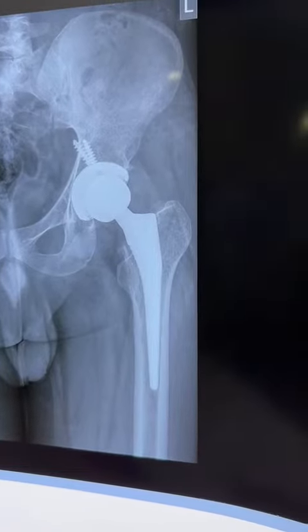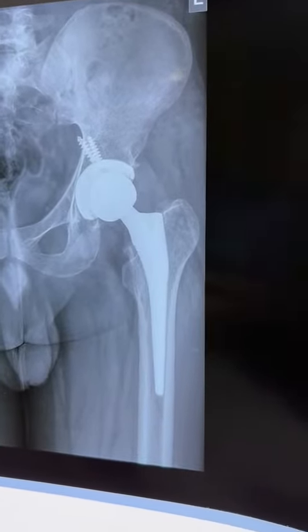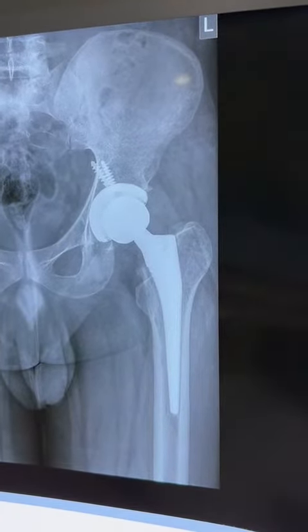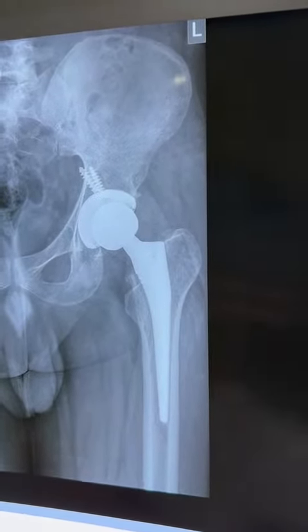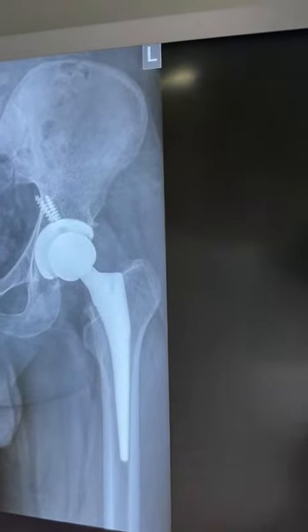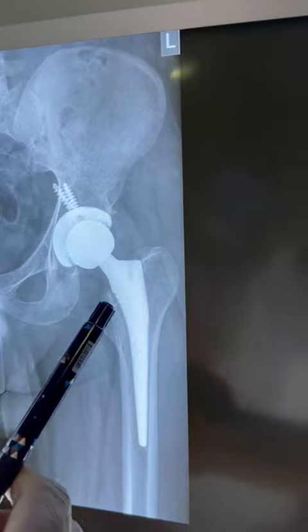In total knee and total hip replacement, there are mainly two types: cemented and uncemented. A third type is the hybrid type. This is an uncemented stem.